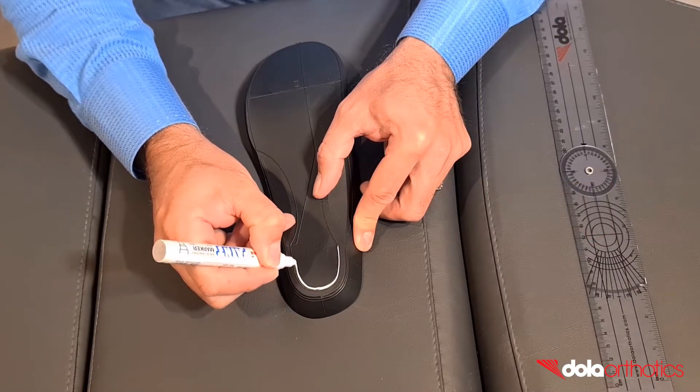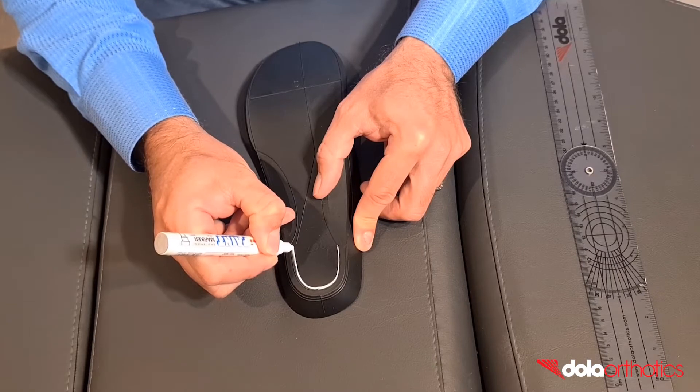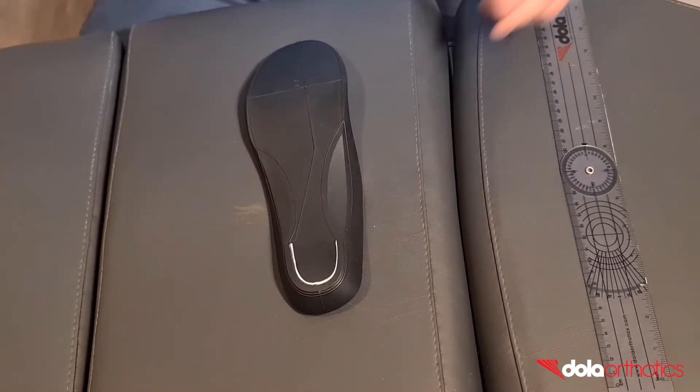Option 2: use a ruler to measure and mark the size of the rear foot post needed to match the footwear dimensions. You now have your rear foot post taper marked and guidelines for grinding.